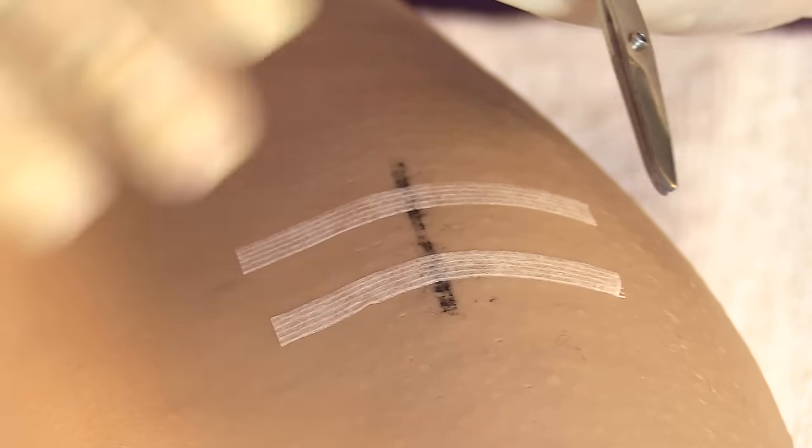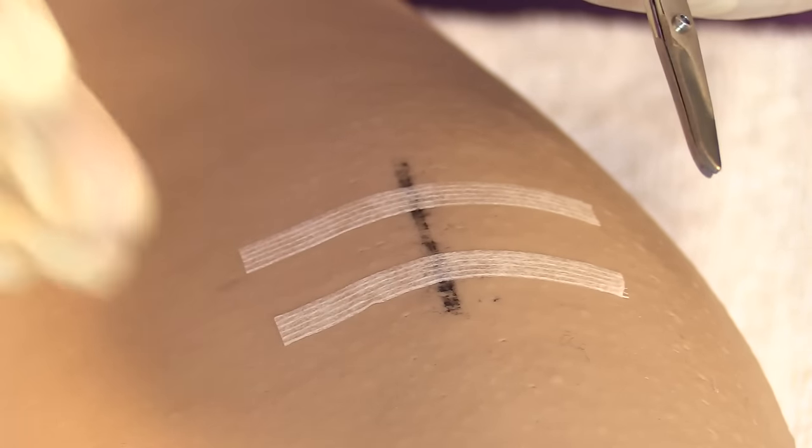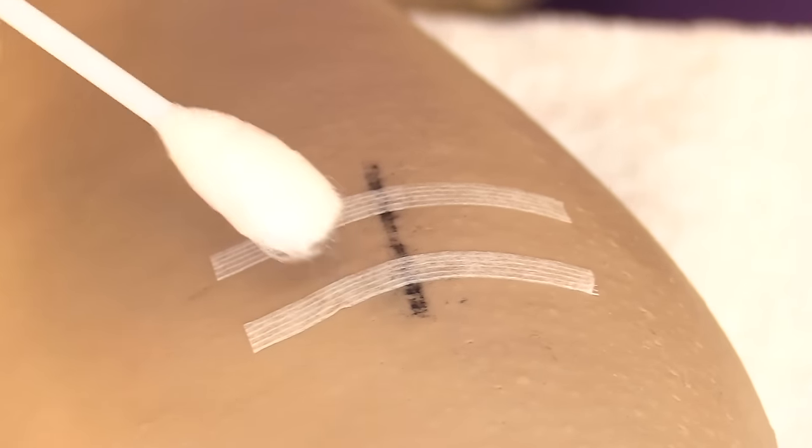If at any point during removal the wound starts to open prematurely, stop immediately. Do not remove any more sutures, cover the wound with sterile gauze, and notify the physician immediately.